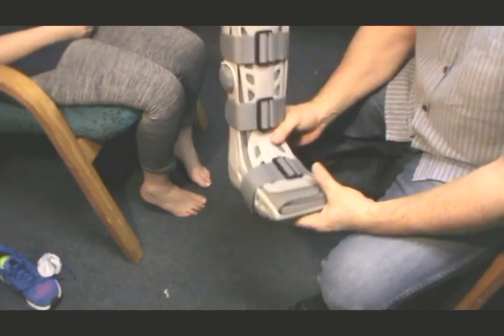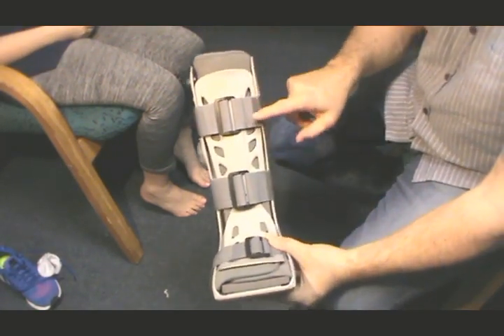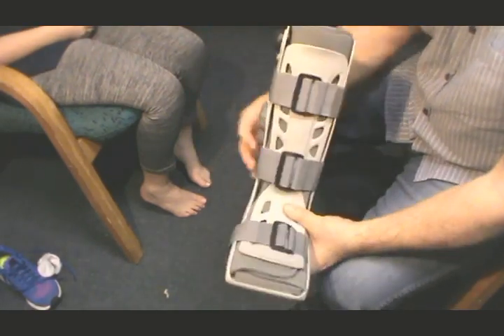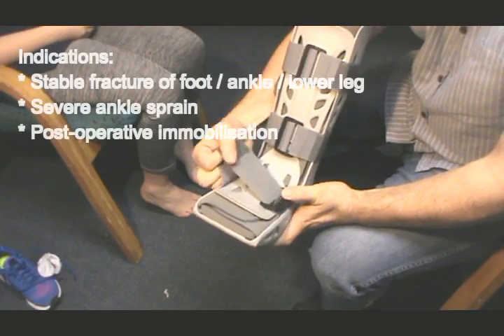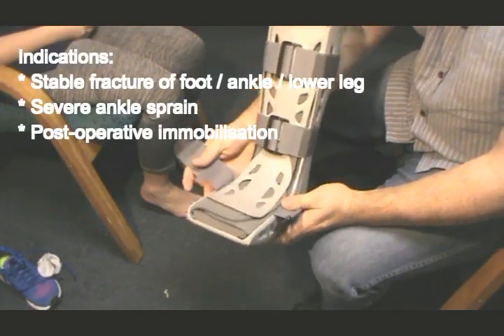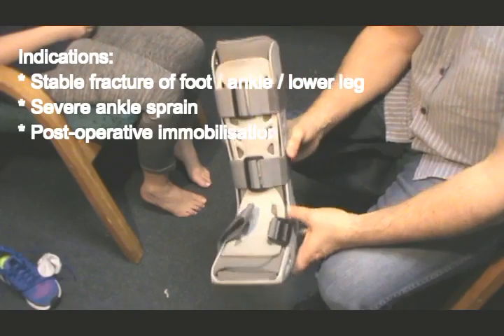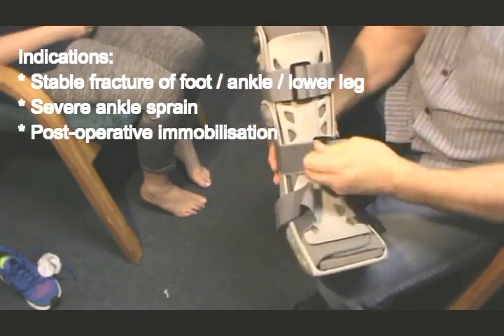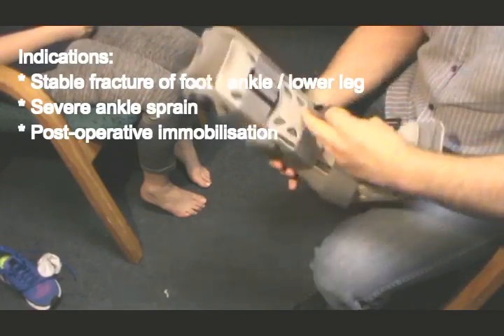So now I'm just going to go through this with you. The first thing is that we've got here is 3 straps, 1, 2, 3. And to loosen the straps, you just pull them loose like that, and they will then go through the buckle. And we'll do all 3 first before we fit the patient with the boot. The straps.